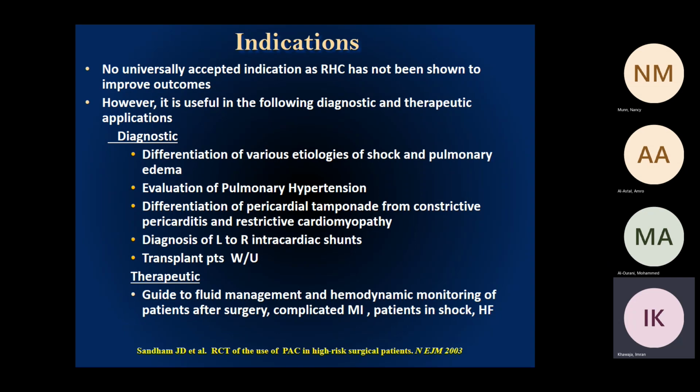As for indications for the Swan-Ganz, there are studies and controversy about its use. They came from studies in the 80s that showed an association between worse outcomes in patients who received a Swan-Ganz versus those who did not. Whether this was attributable to the Swan-Ganz itself, to the patients being too sick, or to the way the data were acquired and applied to patient care, I think a lot of it has to do with the last point.